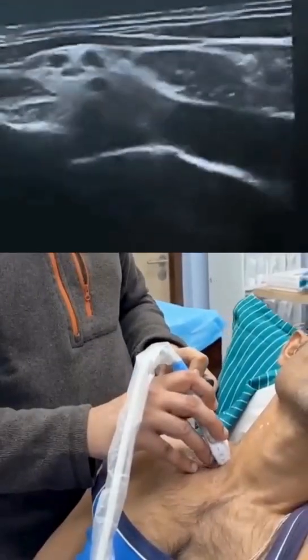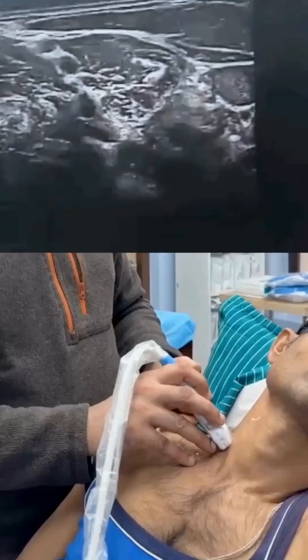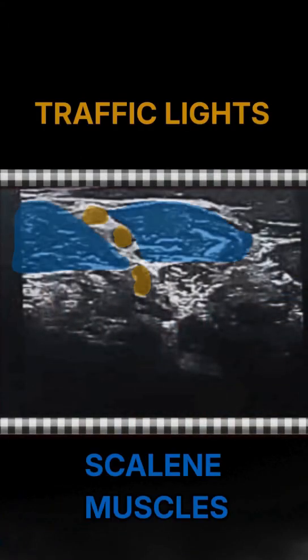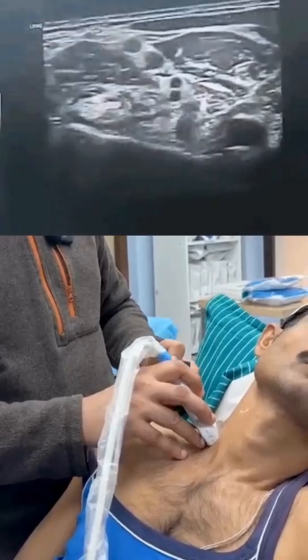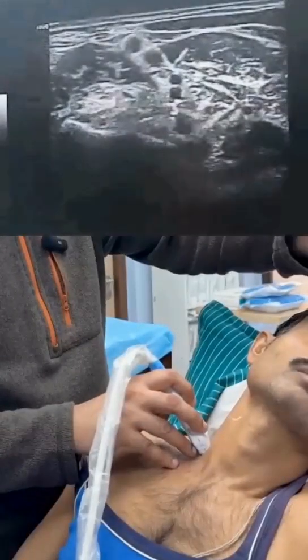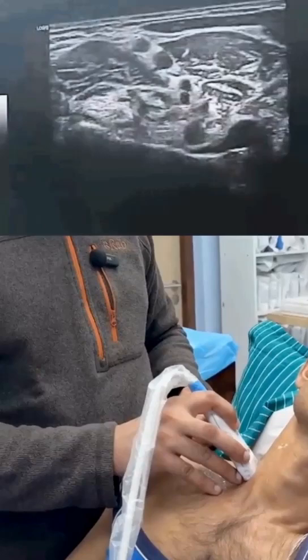As I go upwards, the brachial plexus organizes itself into the interscalene appearance, where you can see in the interscalene group we've got three traffic lights surrounded by the scalene muscles. In the bottom corner you can see the beach chair appearance of the C7 vertebra, with the vertebral vessels in the extreme right lower end of the screen.